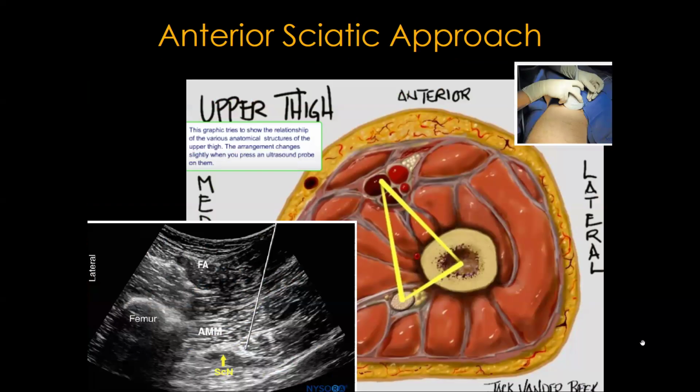All right, now there's something called the anterior sciatic. If you ever want to learn this, I think Mekian does this one. So from the front, you see the vessels and the bone and the nerve. And you drop your needle down between the two, or you come in this way. Now being anterior posterior sciatic. And that's good if you've got a big, heavy patient who's not able to get on their side. It's quick and easy, but just another approach.